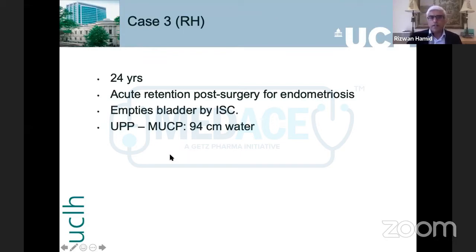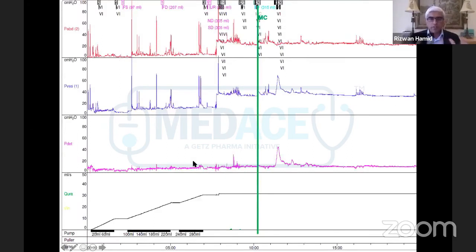So that is high. So what we did was to do urodynamics. Again, I'm not going to discuss the pros and cons. We're not going to get into that controversy. We have decided to do urodynamics. What I want to share with you is how to do urodynamics. Urodynamics essentially is pattern recognition. When we look at a CT scan or an MRI, we are familiar with how the kidneys are, how the bladder is, what to find in hydronephrosis, how to find a bladder stone, where the kidney tumor is. This is pattern recognition.